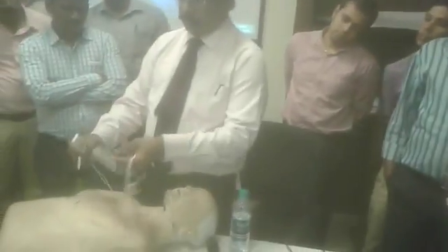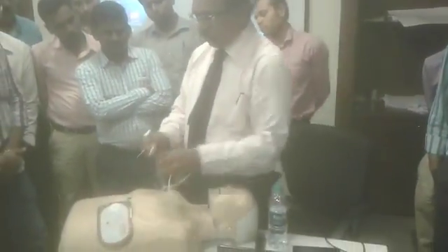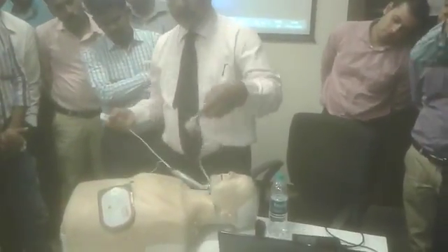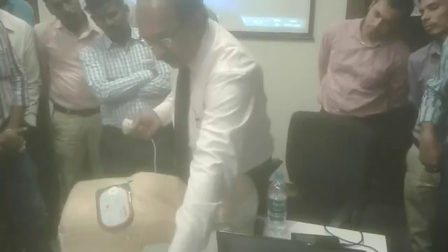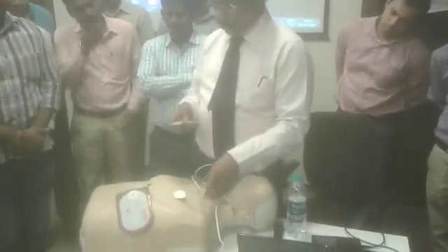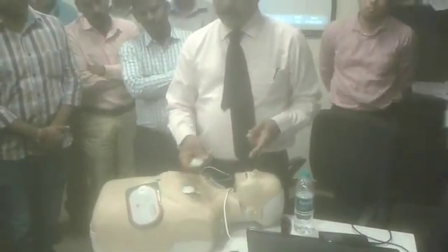You have to remove the sticker behind it and put it in place. If you actually see it, it goes like this, and you have to fix it in the proper direction. Then, when you start the machine, it will auto-prompt. It will tell you what to do.